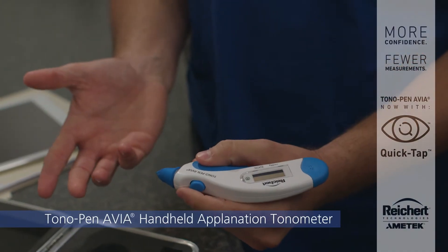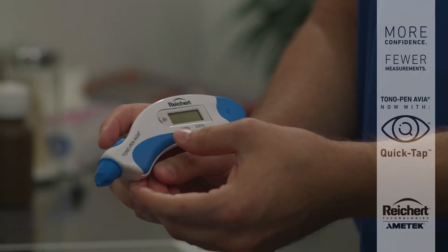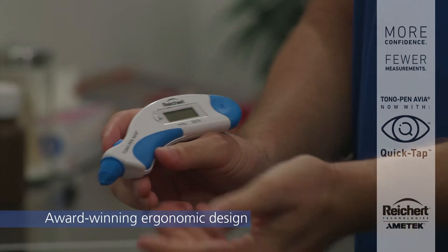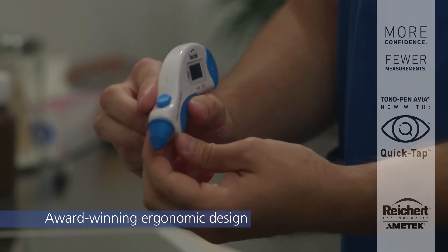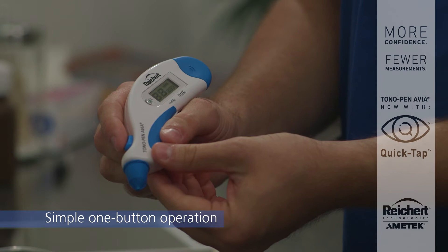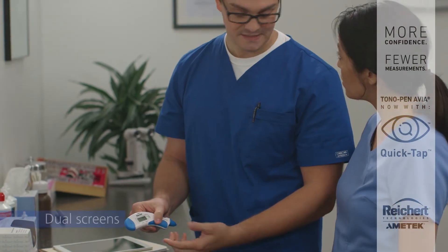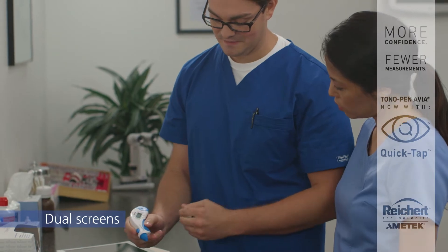With its award-winning ergonomic design and soft-touch grips, the lightweight Tonopan Avia fits comfortably in any operator's hand, ensuring consistent measurement technique among users. The simple one-button operation is intuitive, and the large dual-sided display is easy to read and suitable for both right- or left-handed users.